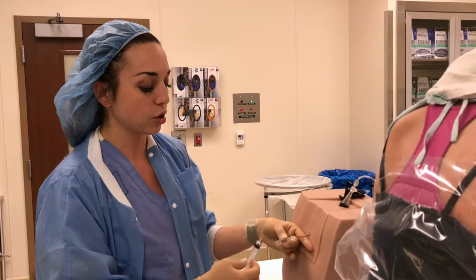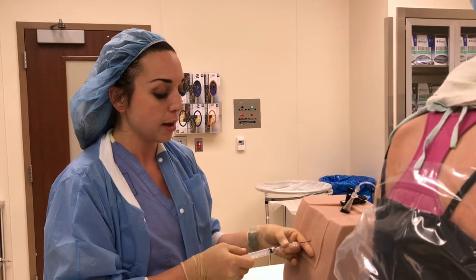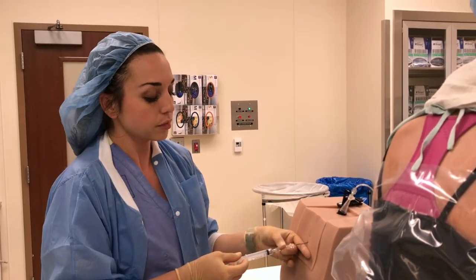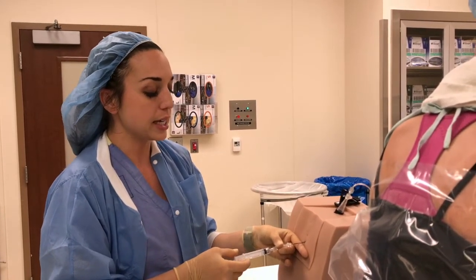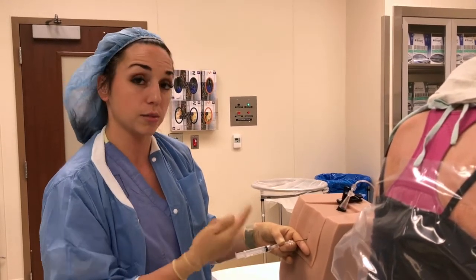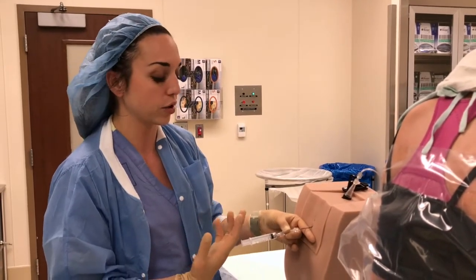Right before the CSF drips out, then you carefully place your spinal syringe on. Many people do differently, but I personally like to withdraw first before I inject. With the hyperbaric solution, the 0.75% bupivacaine, you should see a swirl of the CSF, which is just a nice visual indicator that you're in the correct spot.